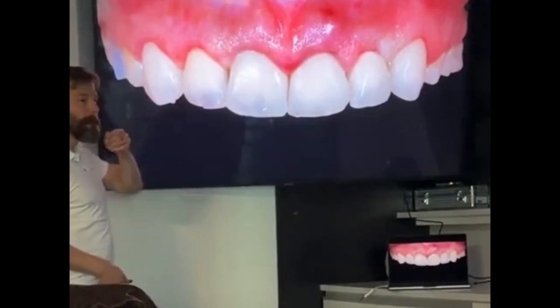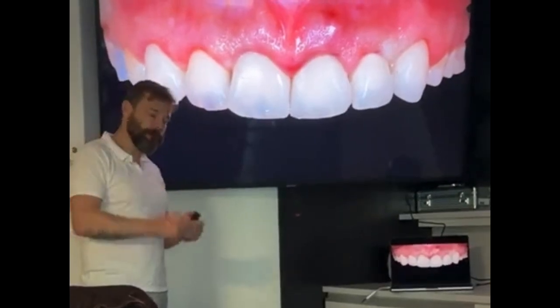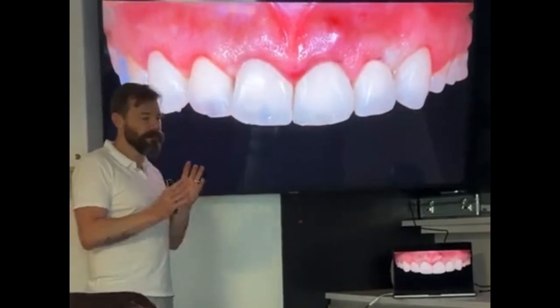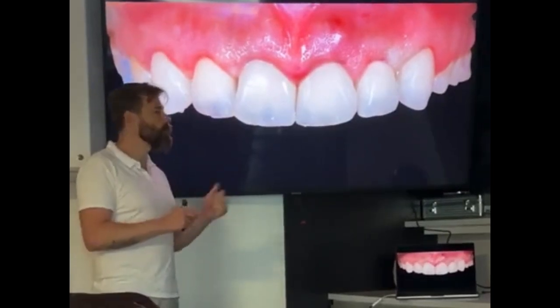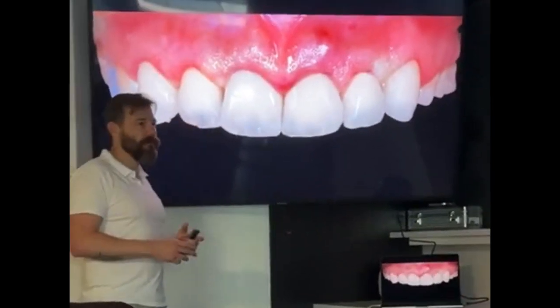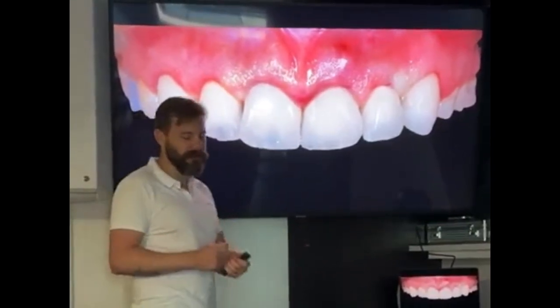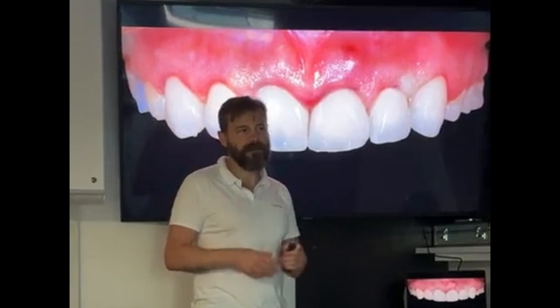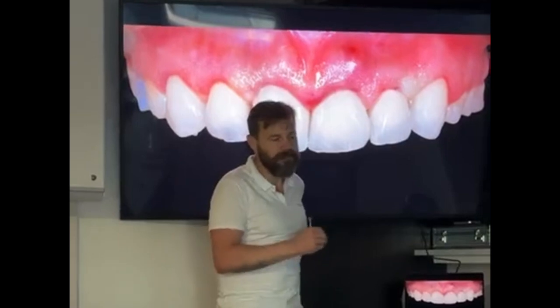How long did it take you to make all the abutments? On that day, my old technician was with me here and helped me to realign the provisional, but usually every abutment is going to take at least 15 minutes for you to realign the abutment, plus 10 minutes to work with the provisional. It means 25 minutes each, so it's a long time, but you just do that once. And the nice part was I was doing surgery, fixing one implant, and he was already realigning, we worked together, right? So that was nice. I finished the surgery, maybe total time a little bit under 3 hours.